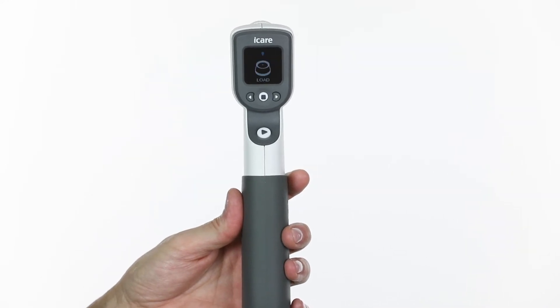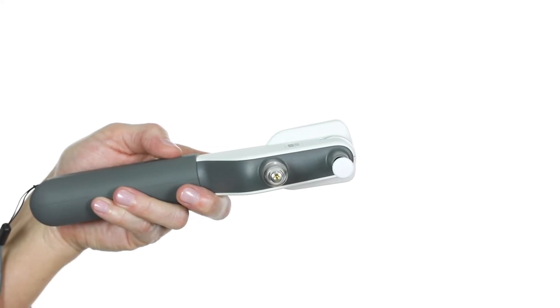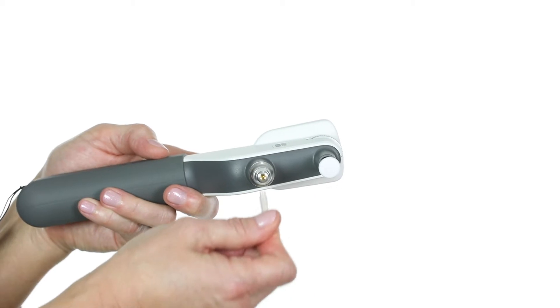Load the probe into the tonometer when the display screen shows load. Open the probe tube and insert the single-use probe into the probe base.